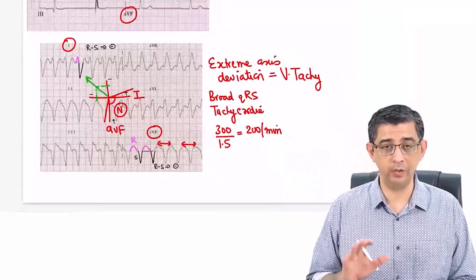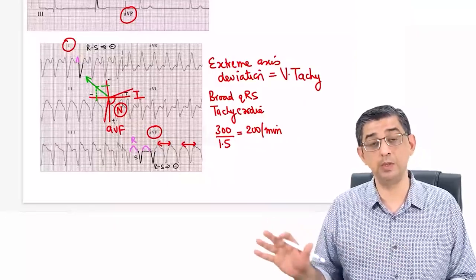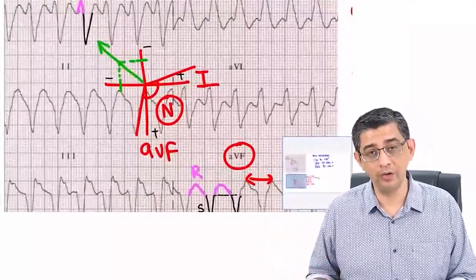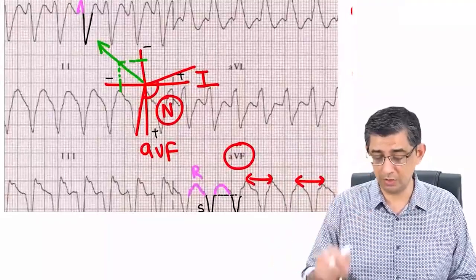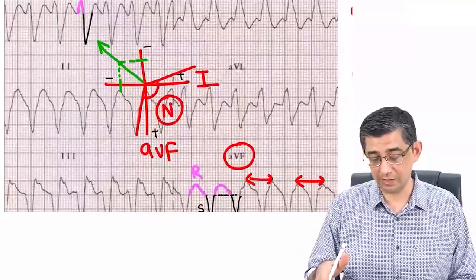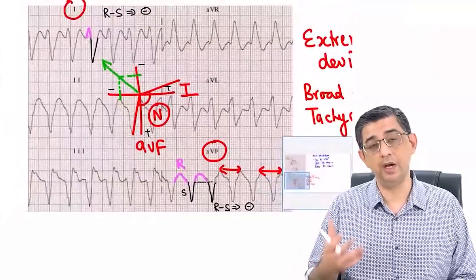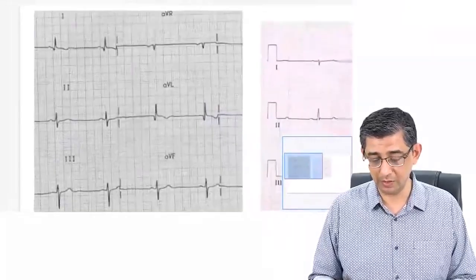Believe me, it looks easier said than done, because when we do mathematics of positive versus negative, I've seen people messing up. And here I still had the flexibility of actually drawing it. In the exam you won't be able to draw it. So I would suggest that when I'm drawing this X and Y axis for 1 and AVF, try to draw with me so that you get a reflex for it. I know it is very simple, but in the exam, in a pressure cooker situation, I've seen people messing up.